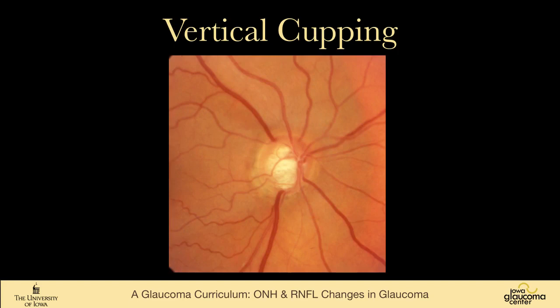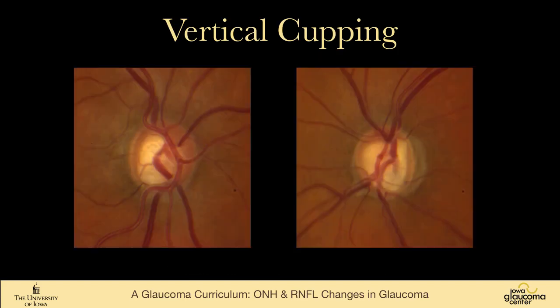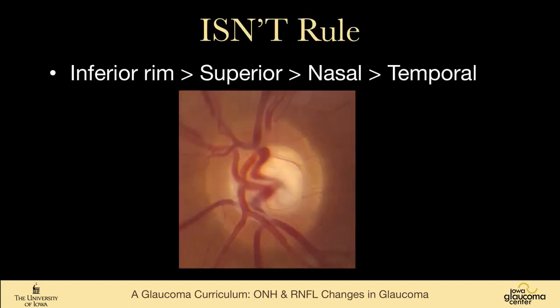More striking here, and you can see inferiorly how very thin the nerve fiber or the neuroretinal rim is right there. This is an interesting patient because she has such distinct focal cupping right here in the right optic nerve, and then both above and below, which is sort of unusual, in the left optic nerve. And she is a patient with normal tension glaucoma.